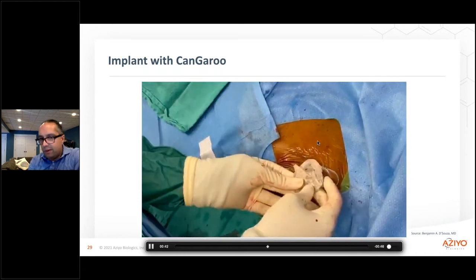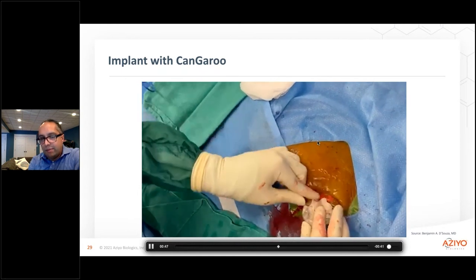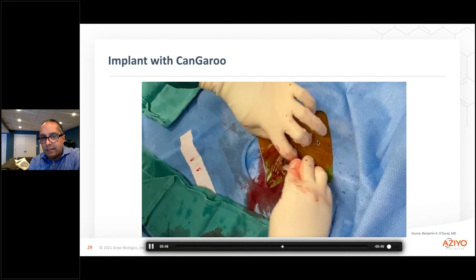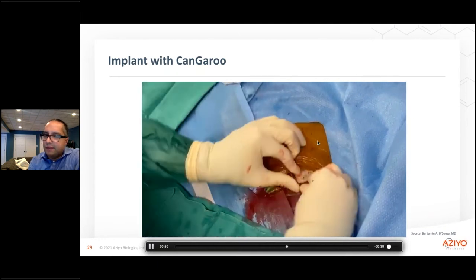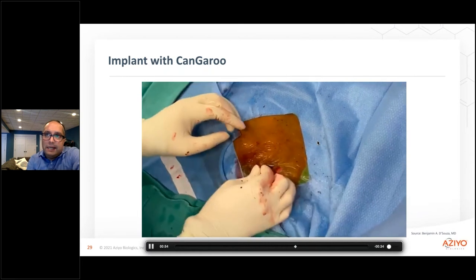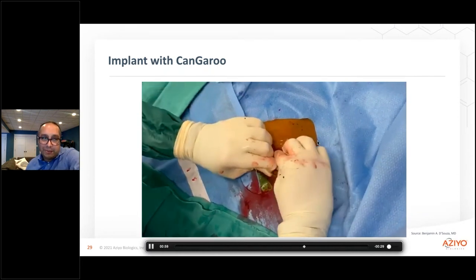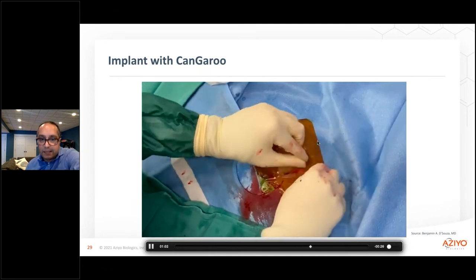This video was taken before I started to take leads and also place them into the kangaroo pouch rather, before putting into the pocket. But it's a lot easier. With synthetic pouches that I've used in the past, I sometimes can't even get it into the pocket — I just cut it and then jam it in there and hope that it helps, which I'm not even sure if it does, to be honest, because that's not how it was designed.